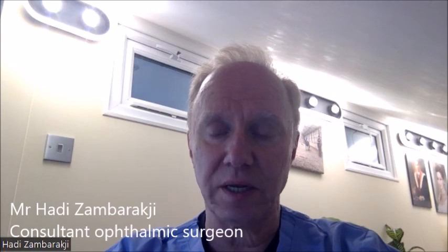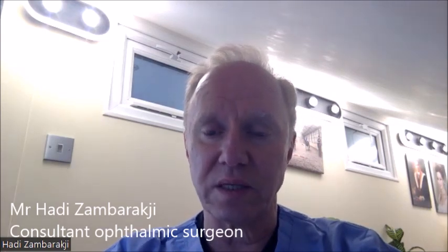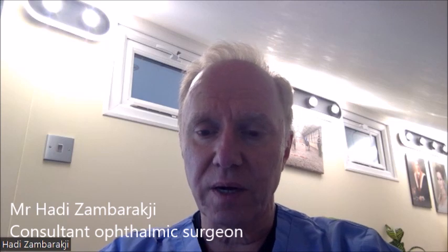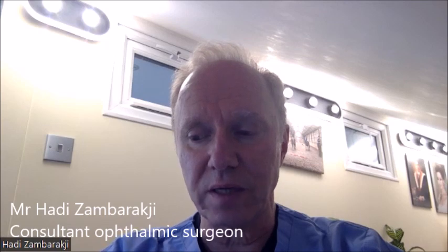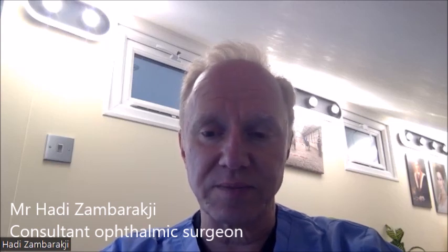But the other option is to give the patient monovision, whereby one corrects one eye for distance and the fellow eye for near. Now, this way of giving the patient spectacle independence by giving them monovision works quite well, and is something that's been done by optometrists for many, many years with contact lenses.